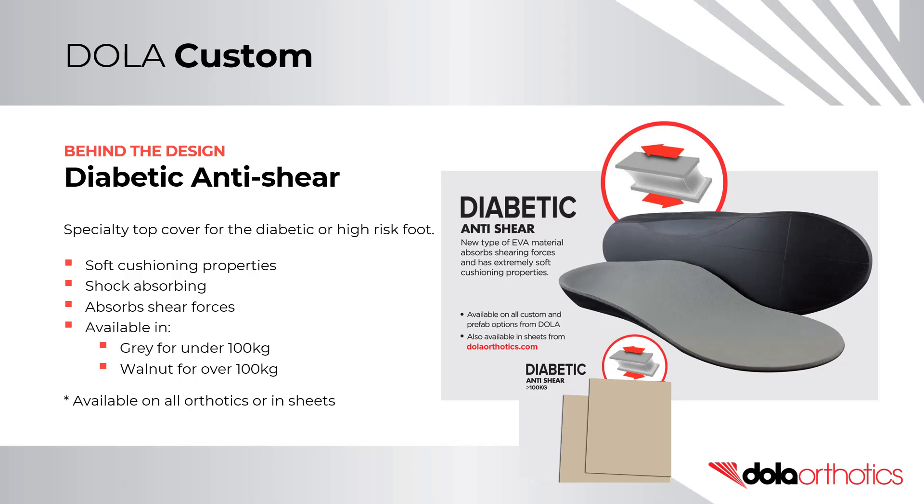Anti-shear is a specialty top cover designed for the diabetic or at-risk foot. It is designed to reduce the effects of plantar tissue stress. It has super soft cushioning properties for shock absorption, while also minimising shear forces. It is available in grey for under 100kg patients, and beige for over 100kg patients.